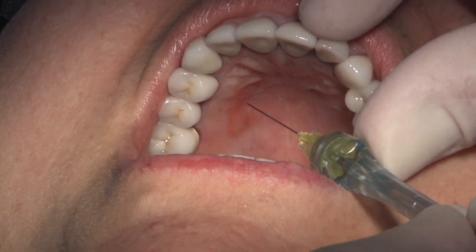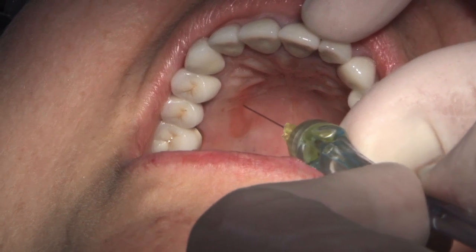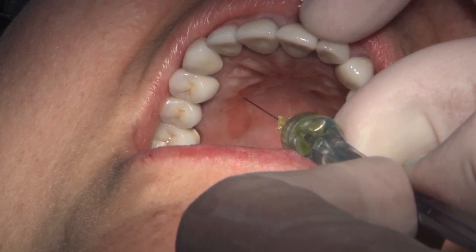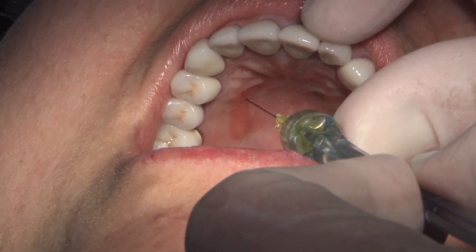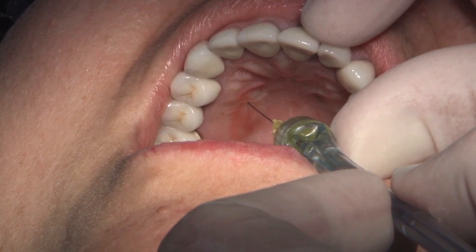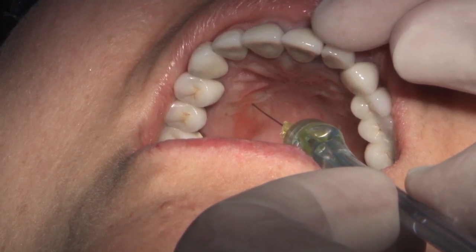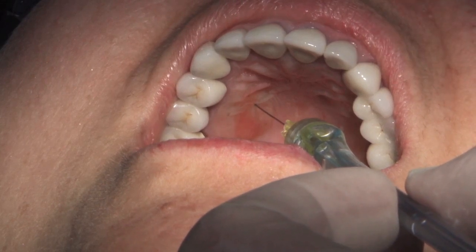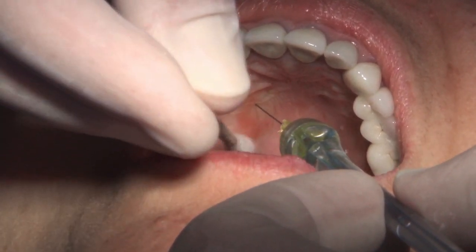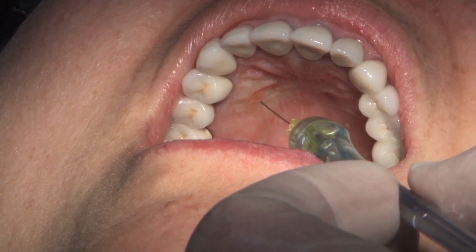We want to park the bevel against the bone — not coming across where we hit the tip first and the bevel isn't against the bone. We want to make sure that angle keeps the bevel right against the bone. From there, make your penetration — it will be fairly shallow — advance until we have contact. For this one, we have our base unit set on the STA setting. We may or may not hear the same signals from the dynamic pressure sensing indicators; we've got dense tissue where that pressure can build up, but it's not necessarily a component of this injection. That's why in our kit we keep sterile cotton swabs ready to go — if we have any backflow, we can be collecting that so they don't have to deal with the taste of it.